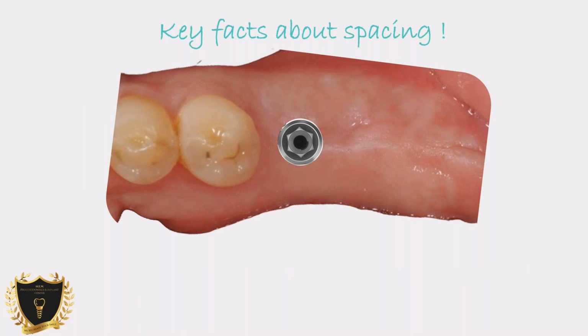If you're placing an implant at the number 30 site, and this is just an animation to give you an idea, you're looking at a 1.5 millimeter distance from the adjacent tooth. So remember that tooth to implant distance, 1.5. Dennis Tarnow talked about it. Ideally, buccolingual width should be a minimum of 1 millimeter. Ideally, it needs to be 2 millimeters. The more buccal or lingual bone you have, the more success. This is an ideal environment, but you cannot place an implant with no bone on the buccal or the lingual. I would say 1 to 2 is very important.